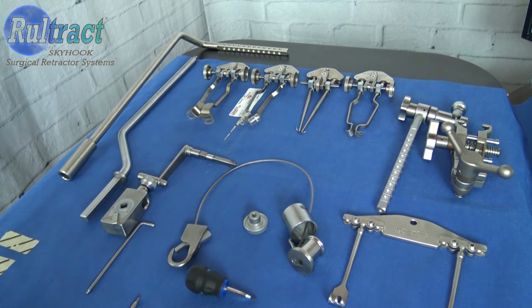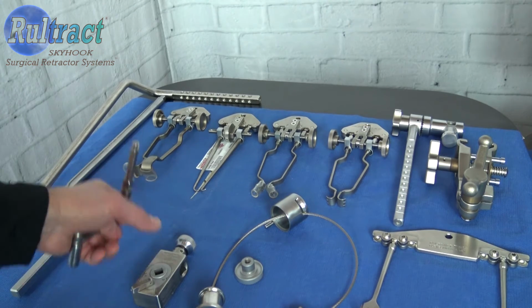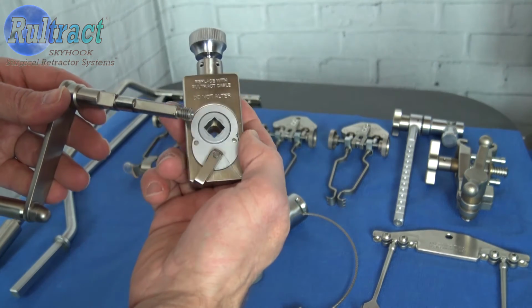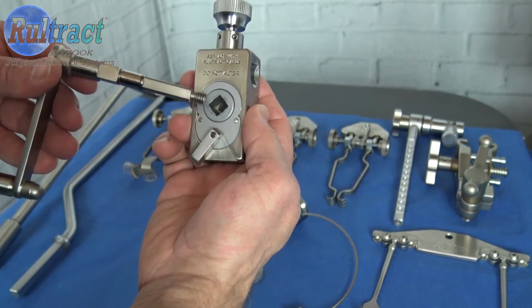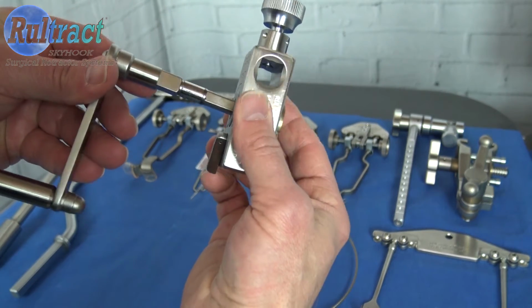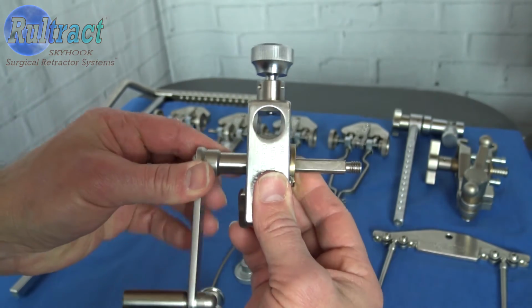Now we are ready to reassemble your Rultract ratchet rake assembly for sterilization and use. Now the first thing that we're going to do is put the crank handle back into the gearbox. Now if you remember, when we disassembled it, we removed it from a square hole. So we want to make sure that we're inserting it back into the square hole and not the round hole. So go ahead and put your crank handle into your gearbox. Make sure that it sits flush.